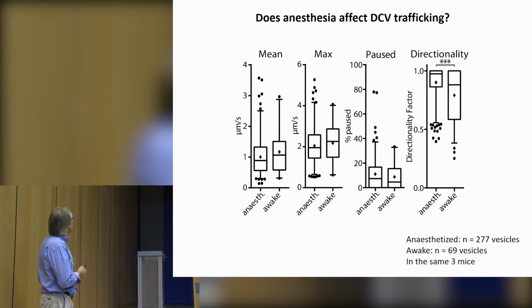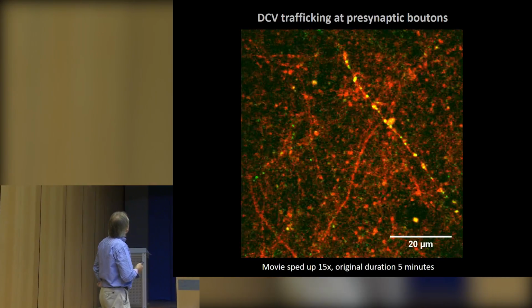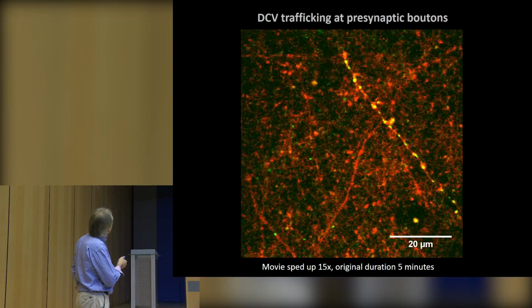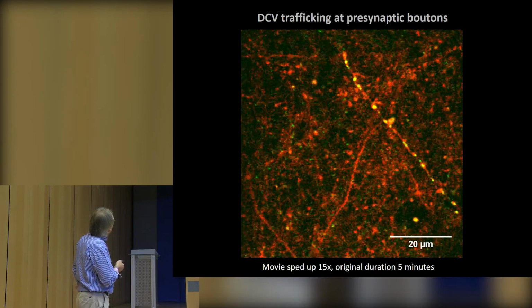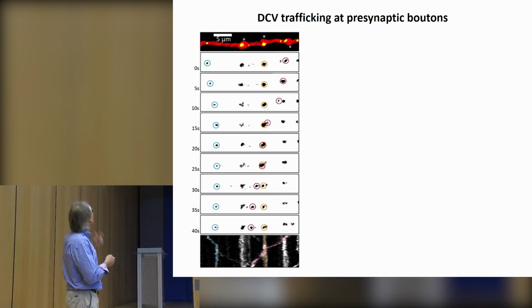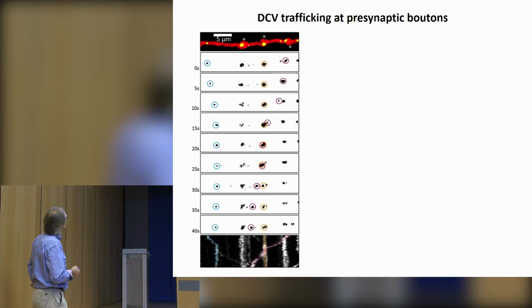But that's an observation. All right, so then one thing that we also looked at, because we noticed that when vesicles actually approached these boutons that you can see here, they seem to be slowing down, and this is something one can see here. So there are vesicles coming along here, and then they enter the bouton and slow down upon entry, upon approaching the bouton, and this was quantitatively analyzed here. So these are, let's say, 3 boutons in this axon stretch, and then we have traced vesicles. So the red one comes in here and then stays in that bouton, and then leaves the bouton again, which can be also seen by this kymograph trace.